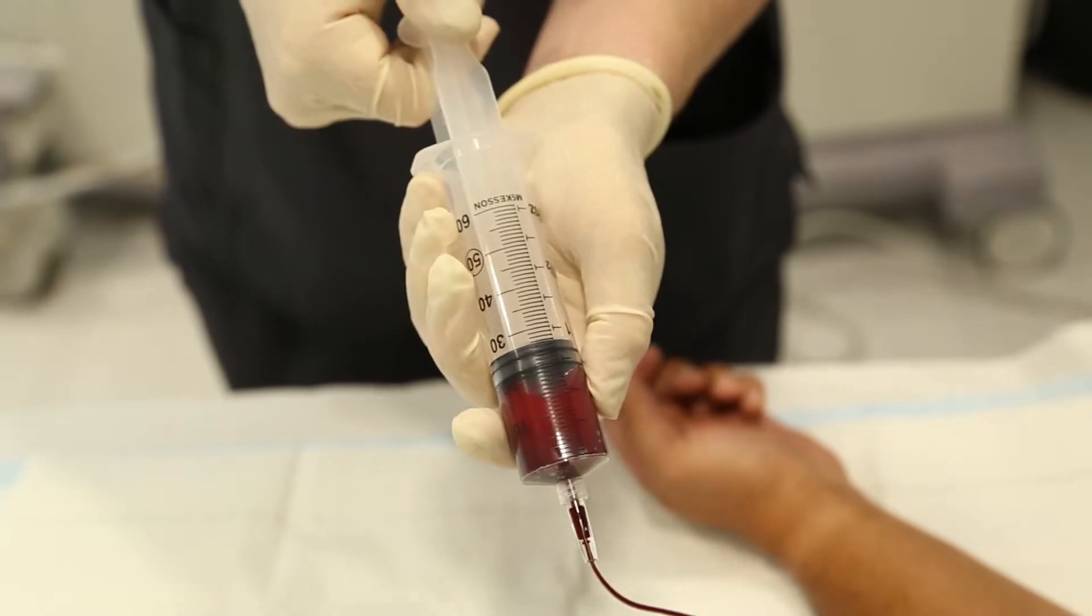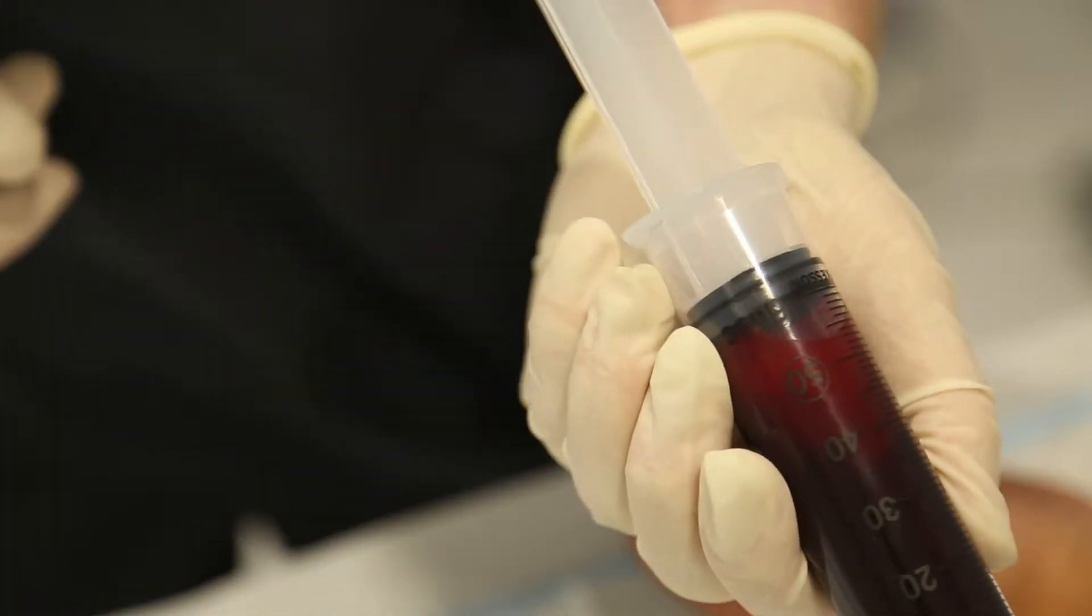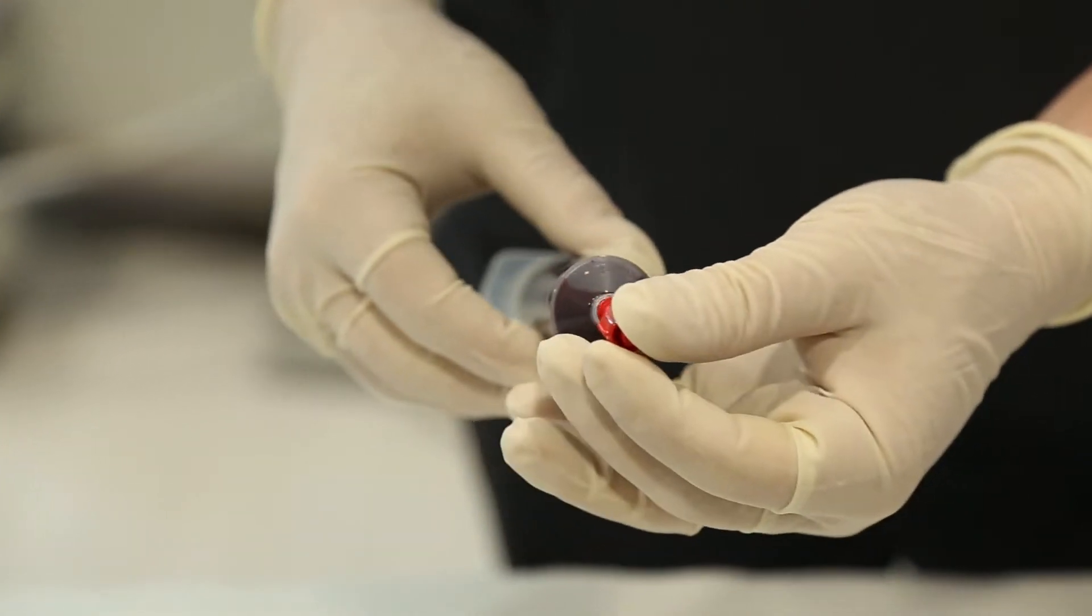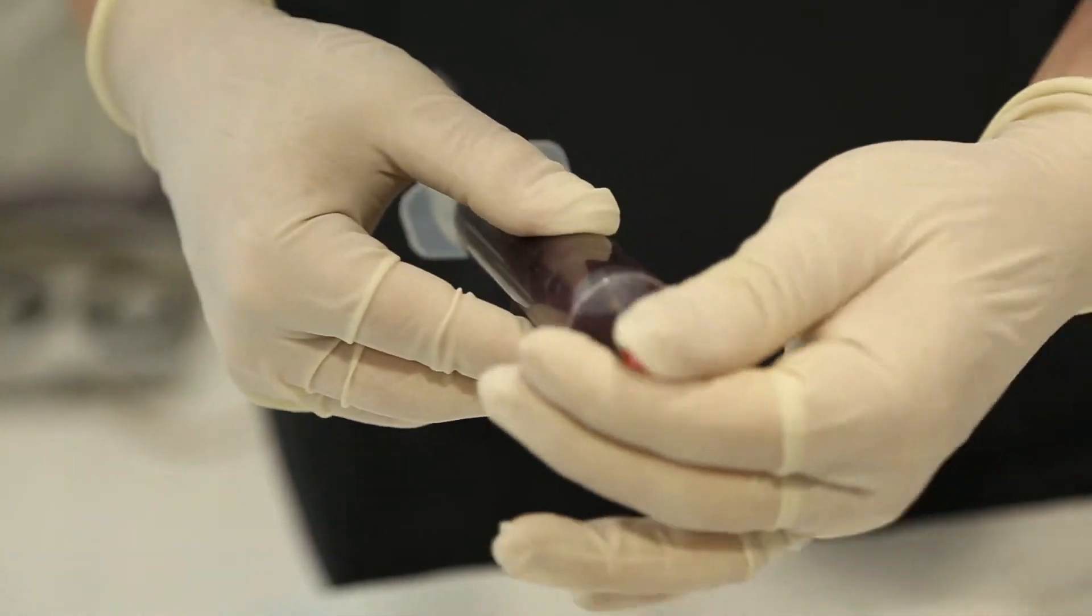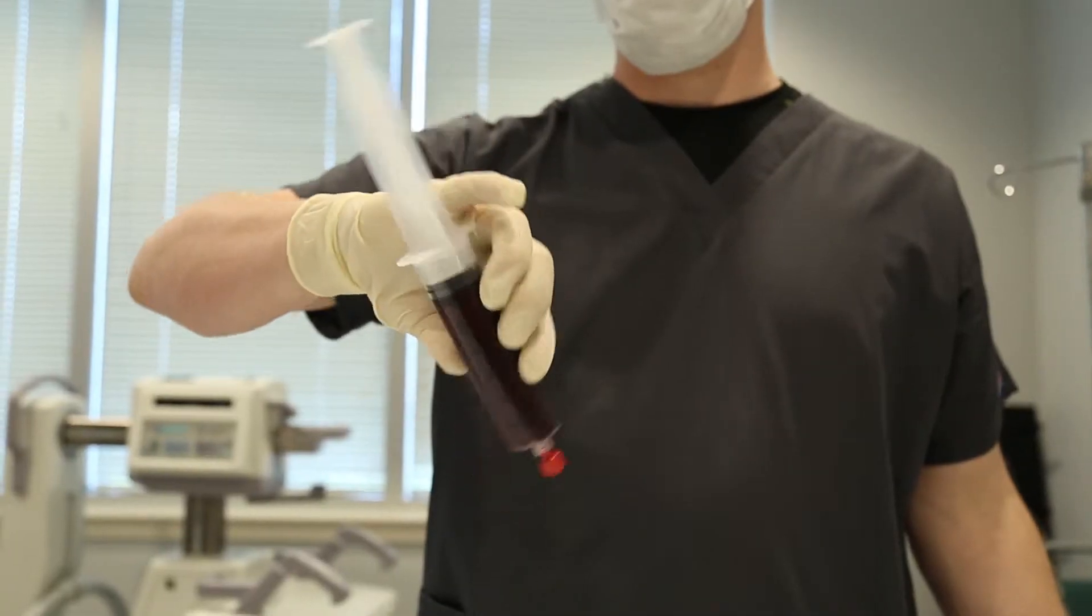Draw whole blood from the patient filling the syringe to a maximum of 60 ml. Once the blood is drawn, detach the tube and ensure the anticoagulant mixes throughout the blood sample.